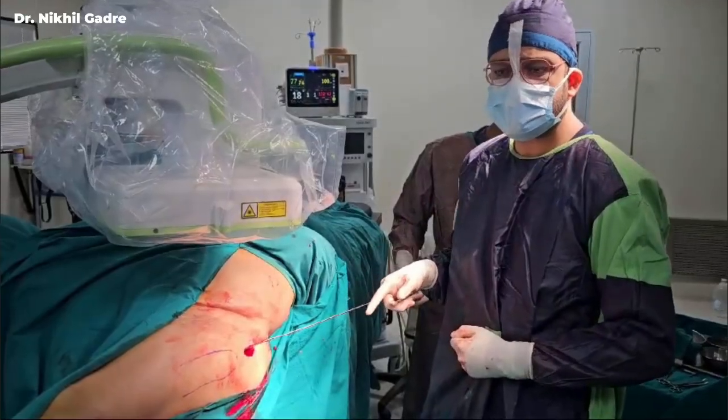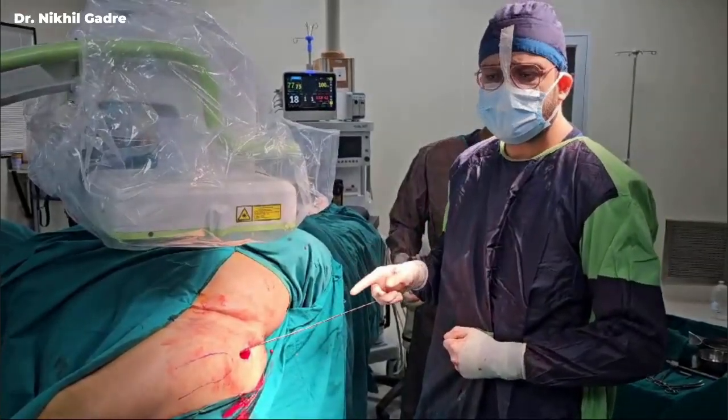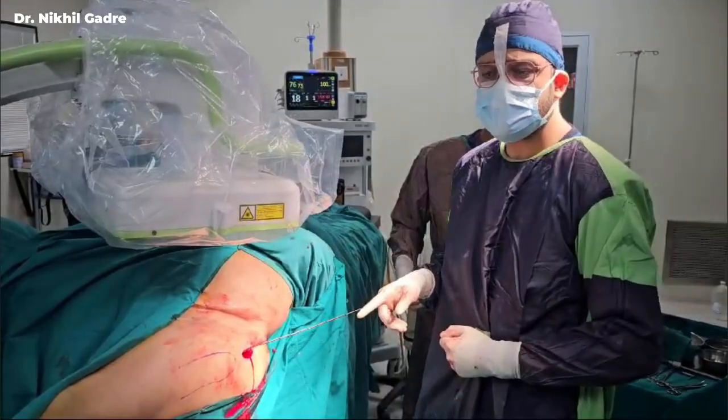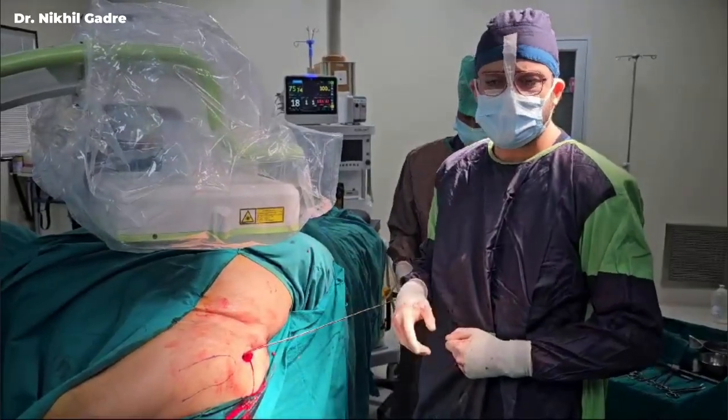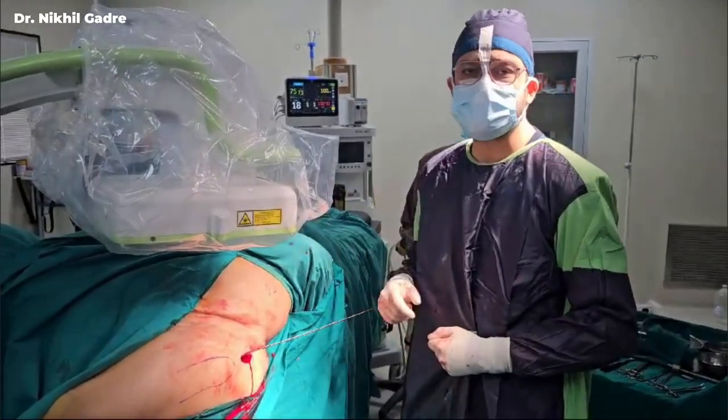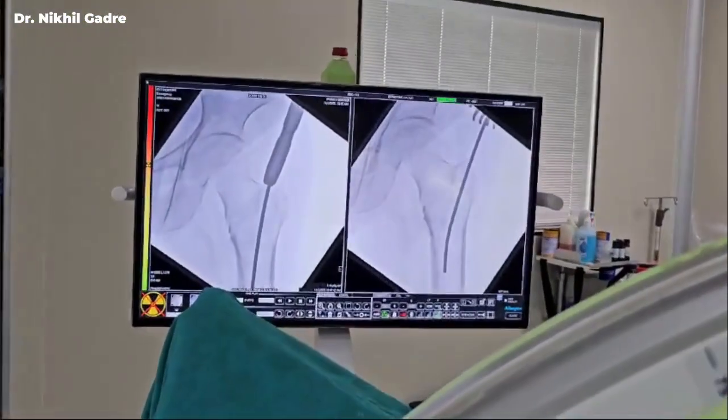Also, in our setup, we have a practice of giving DVT prophylaxis from the time the patient is admitted. Usually, we give injection Fraxiparine 0.4 ml pre-op, and we withhold it 12 hours before the surgery and restart it 12 hours after the surgery. This is your entry of the nail.